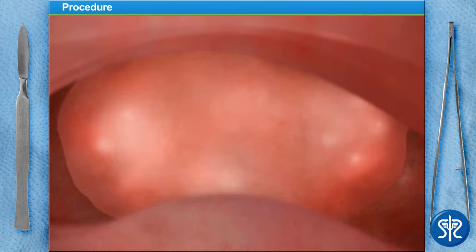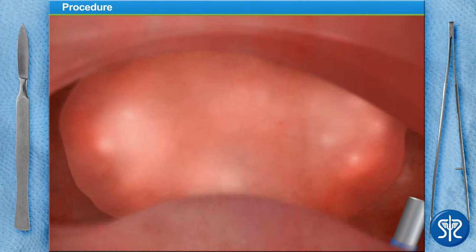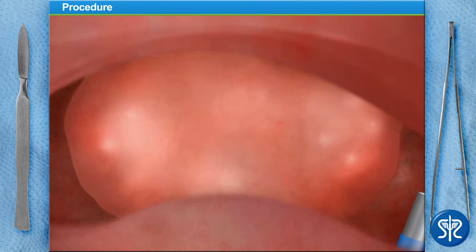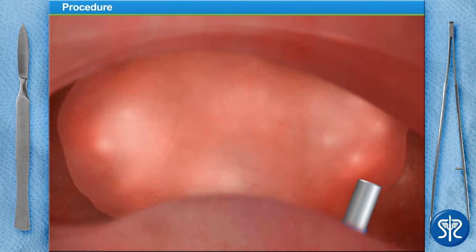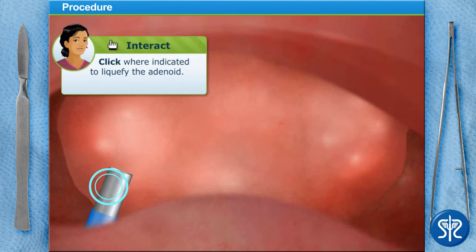We're going to remove the adenoids using a device that uses suction cautery. The device uses electrical pulses to liquefy the adenoid, then suctions the liquefied adenoid out. This method is faster and results in less bleeding.